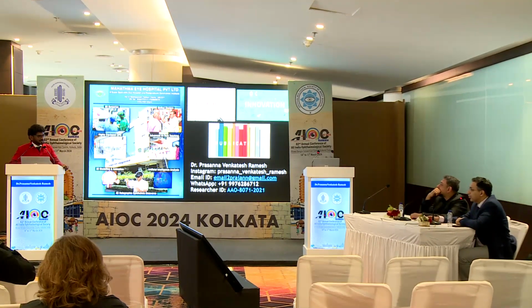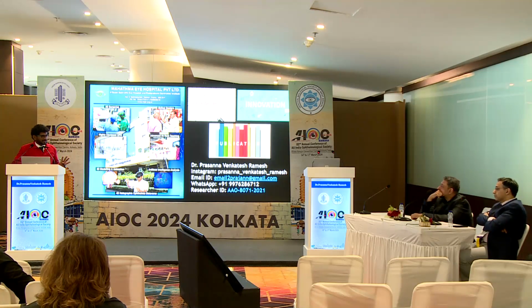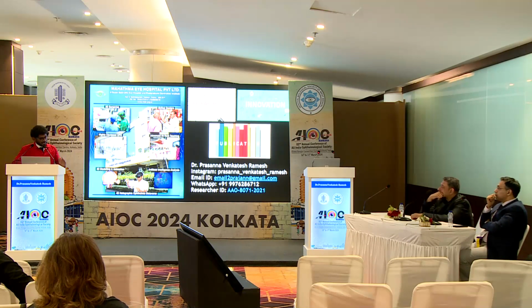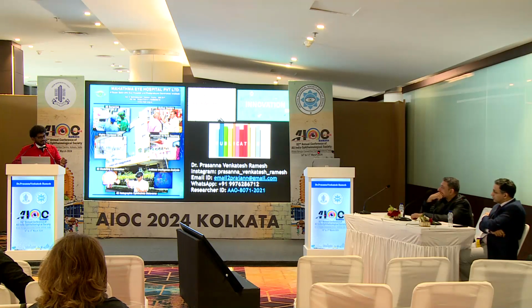After I do a combined procedure, clinically if the IOP is under control, I am very happy. I don't go and over-explore. Only if the IOP is not controlled, because I am taking a mild or moderate case along with the phaco. I do a phaco and then a MIGS. When the IOP is not under control, then I need a non-contact modality because immediate post-op gonioscopy is not going to be done. I do an Anterion. If Anterion is seeing that there is some kind of trabecular meshwork that is remnant, that could be the cause, and at least I can start the patient on a medication. Then maybe, if the patient is able to understand, I can go for another surgery.